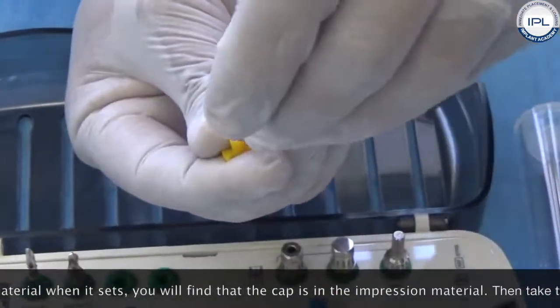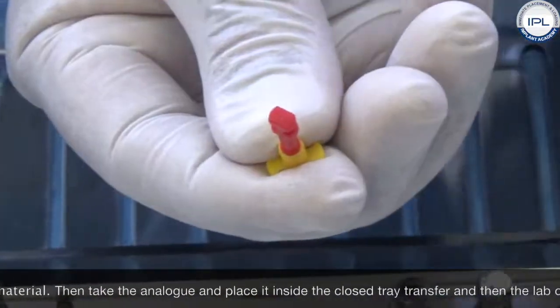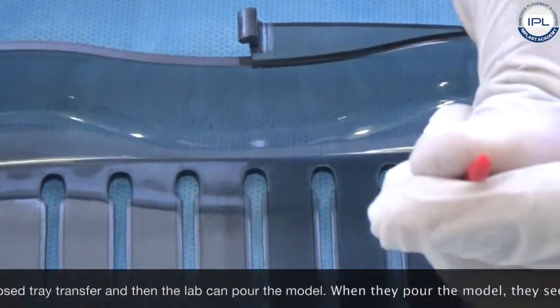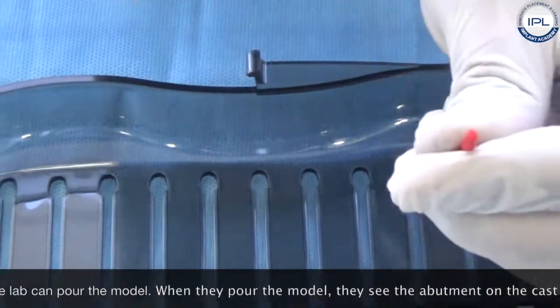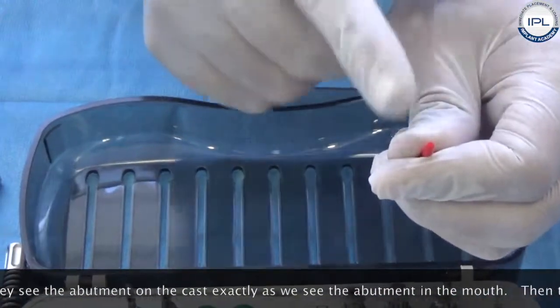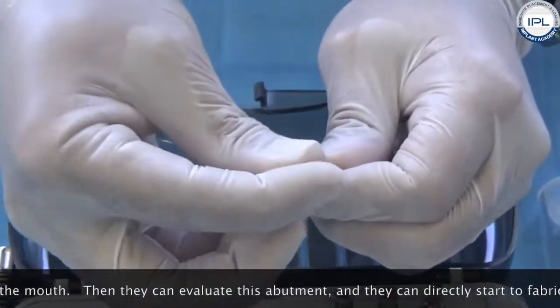Then you take the analog, place it inside the closed tray transfer, and the lab can pour the model. When they pour the model, what they see is the abutment on the cast exactly as you see the abutment in the mouth. Then they can evaluate the abutment and directly start to fabricate the crown.